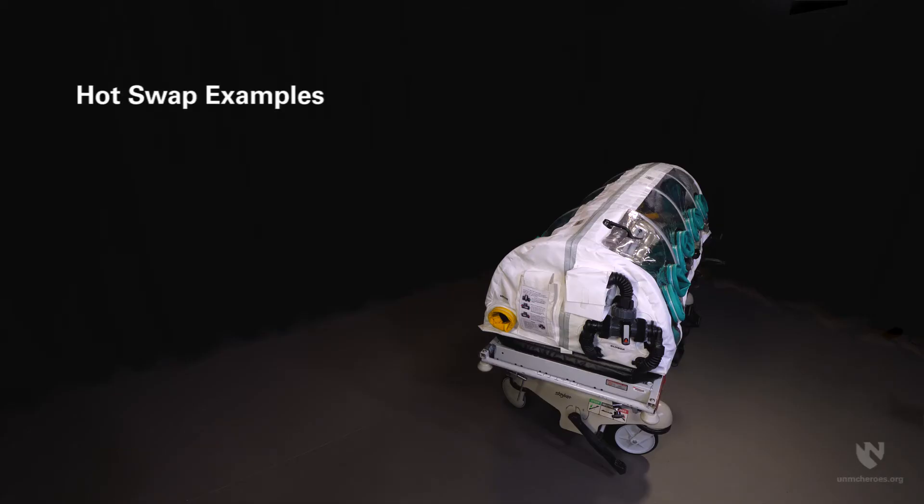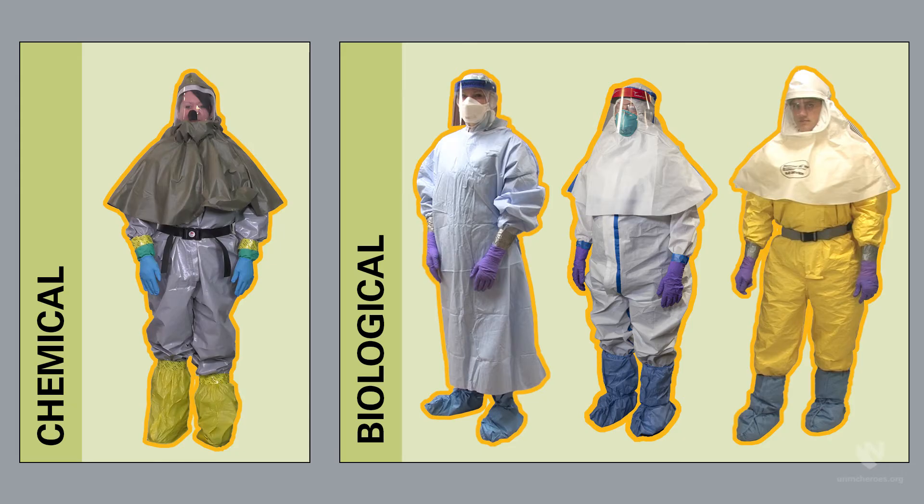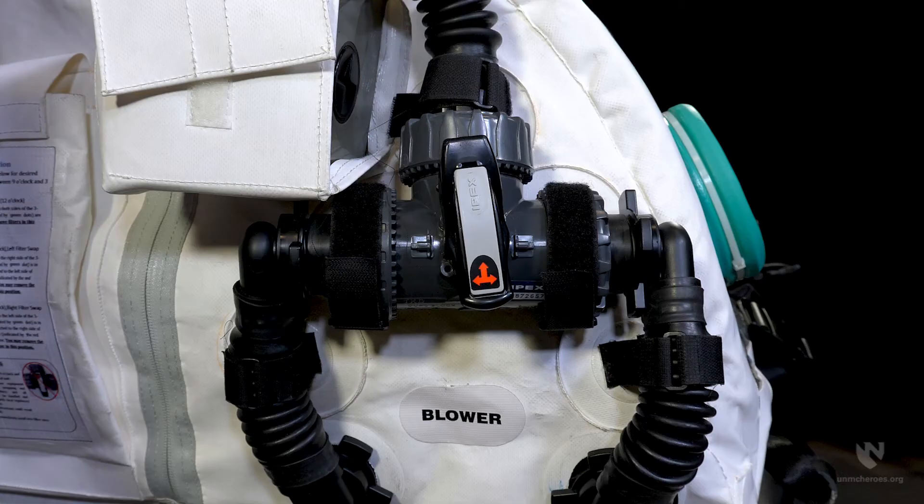A hot swap is performed in the event that first responders or healthcare providers experience chemical breakthrough, a filter becomes soiled or damaged, or the patient finds it difficult to breathe. If such a procedure is performed, users must be in the appropriate level of PPE for the chemical or pathogen to mitigate exposure risk. During the swap, the internal HEPA OVAG filters necessitating the exchange must be isolated using the three-way valve to prevent unfiltered air and contaminants from entering the user space via the filter port.